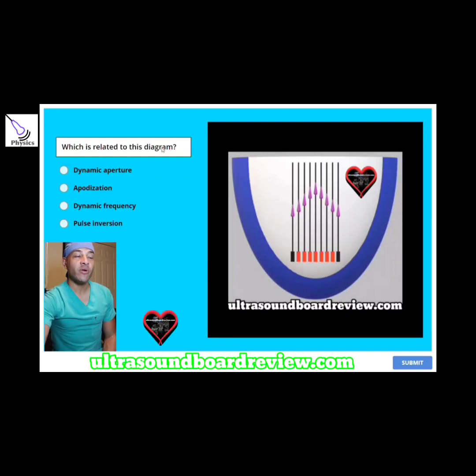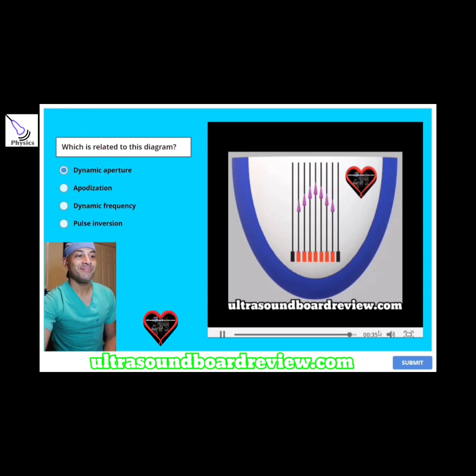Which is related to this diagram? A. Dynamic aperture, B. Apodization, C. Dynamic frequency, or D. Pulse inversion? The answer is A. Dynamic aperture.